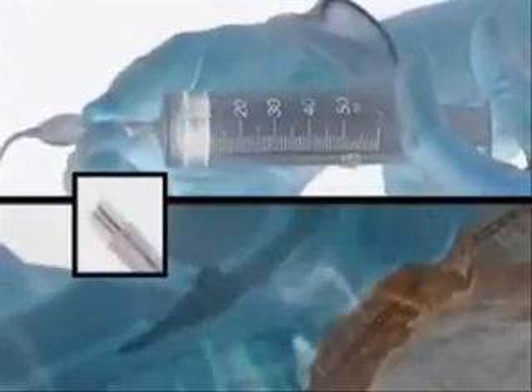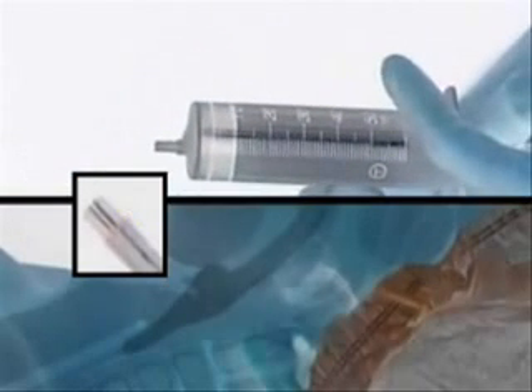Then, with a pre-prepared syringe, inflate the correct volume. You will notice that not only is the cuff inflating in the pharyngeal cavity, but the connector is also rising slightly, which is an indicator that the laryngeal mask has been fully inserted.